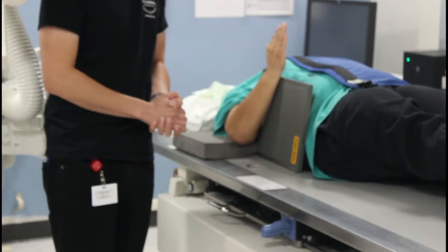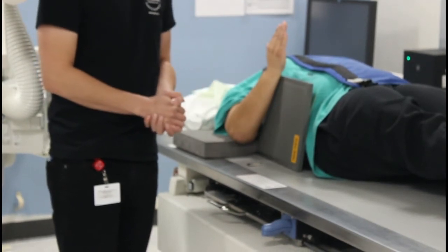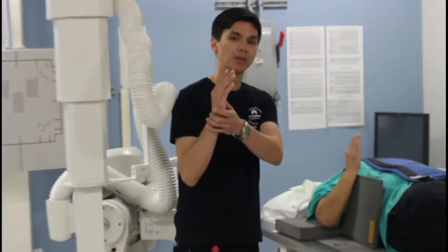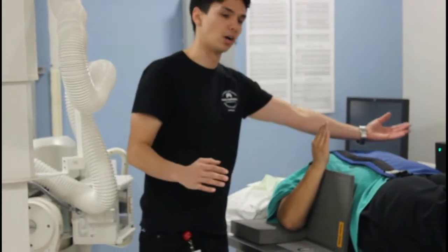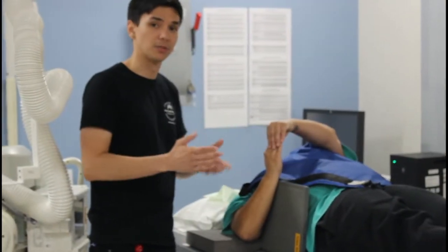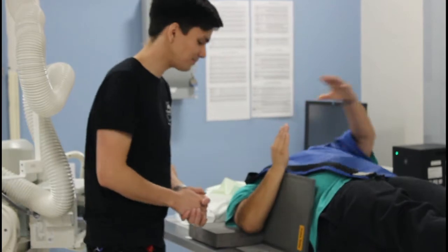midline of the IR. Another tip that I can give you is if the patient is having difficulty holding their arm up in that superior position, you have the patient's other arm come around and grab this hand for stability. Thank you, Mel. You're welcome.